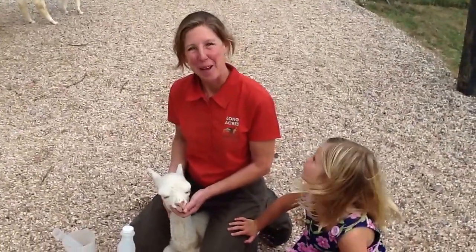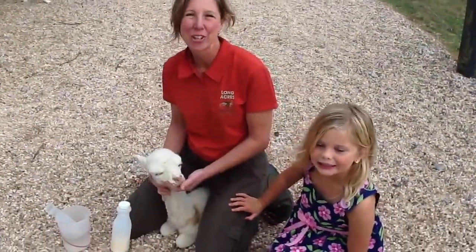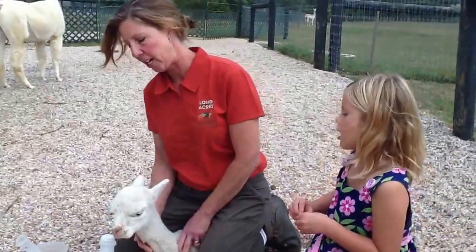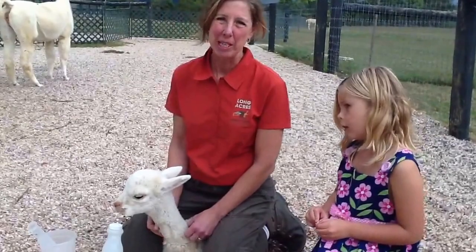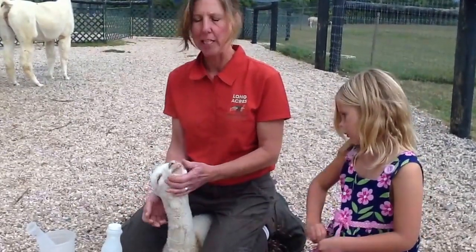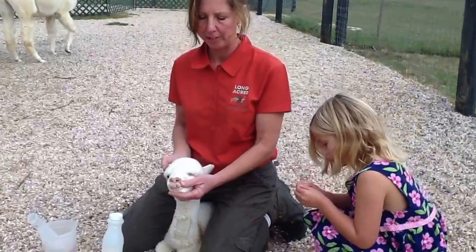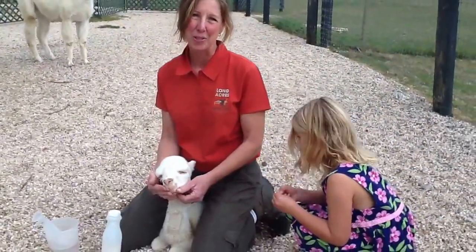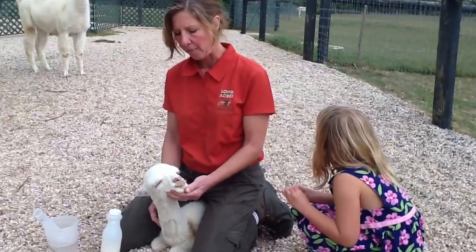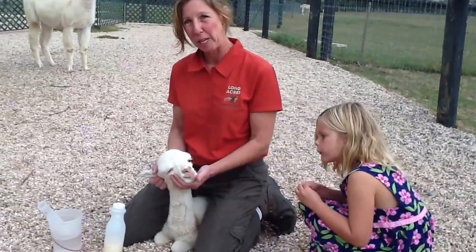Hi, Sarah back from Long Acres Alpaca Farm again, and today I'm going to show you how to insert the feeding tube into a cria. This cria is a preemie and has not really been growing real well. Initially he took the bottle, but then once he got under the dam, he no longer wants the bottle, and that happens an awful lot, far too often. So our alternative is to put a feeding tube in.